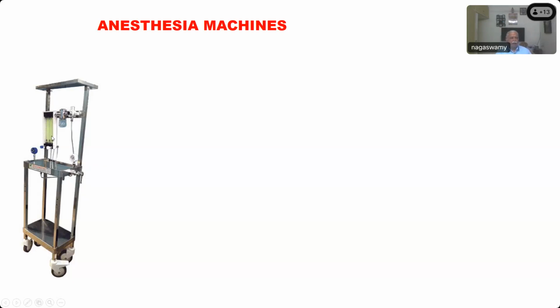And how many flow meter tubes are here? Of course, the picture is in a profile fashion. Three, sir. Three. You can see three bobbins here clearly. Even though you are not able to see clearly the flow meter tubes, you are able to see the three bobbins. So there must be three gases which can be accommodated. Okay.